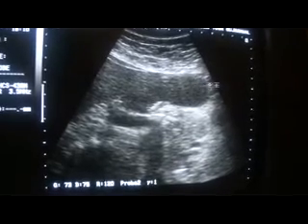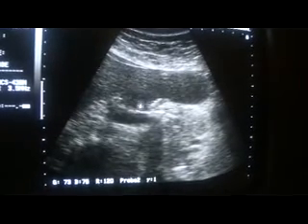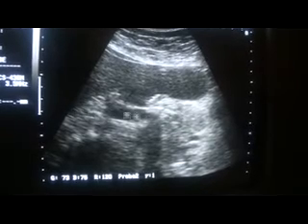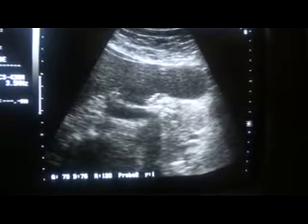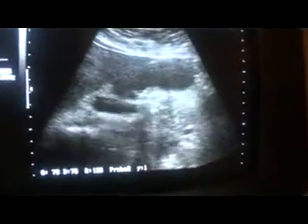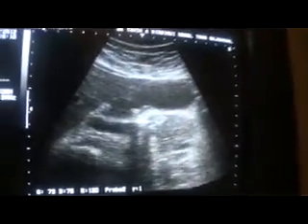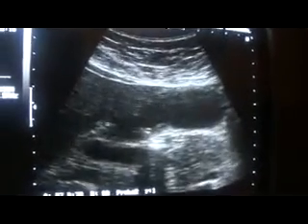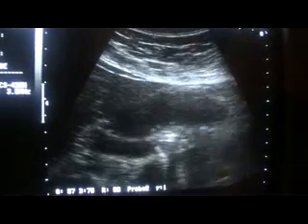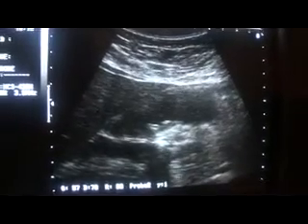This is the neck region, and here you see these areas are tiny calculi within the gallbladder, and this is the portal vein, the landmark for the identification of the gallbladder as it lies at 90-degree angle to the neck of the gallbladder.